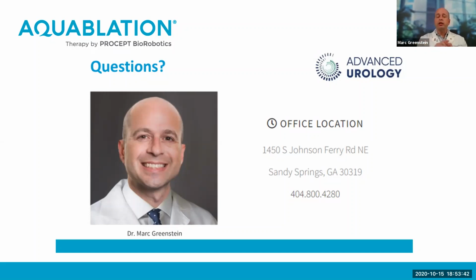The other thing is, we're not going to disrupt the blood supply to the penis at all. And if the blood supply to the penis is good, that's all that matters as well. Those should be spared, and the erection should not be involved and should not be harmed with aquablation. Let's see, next question.